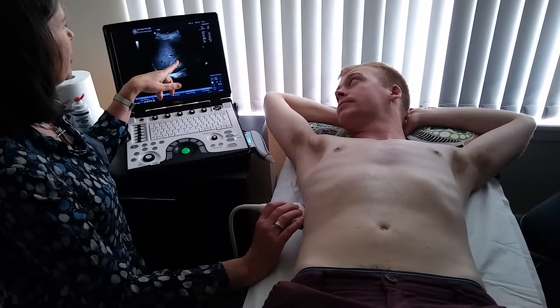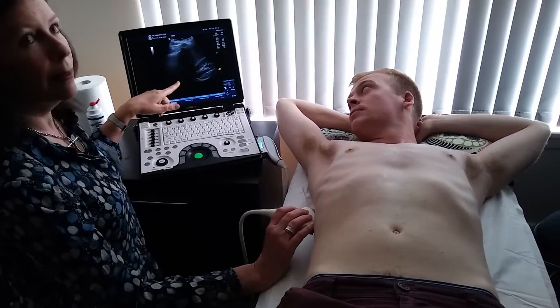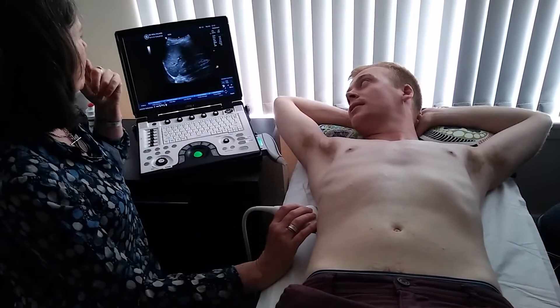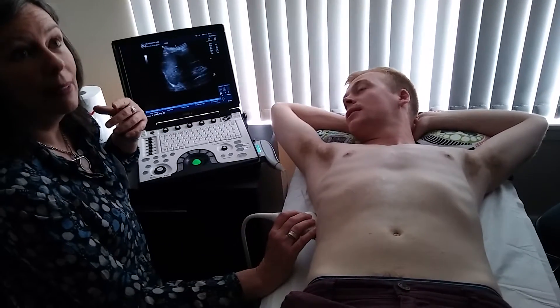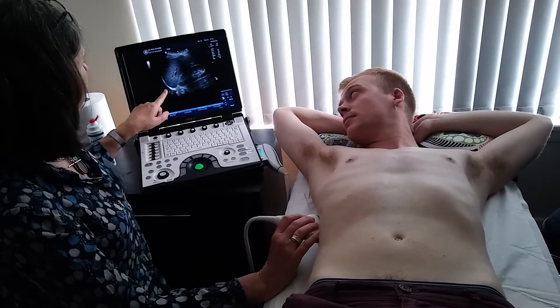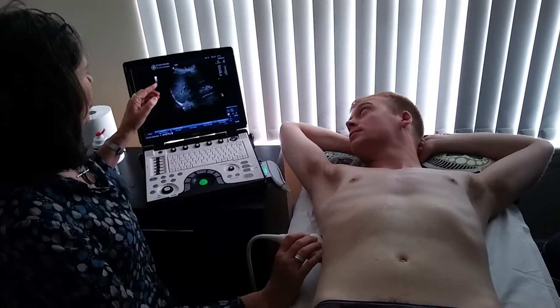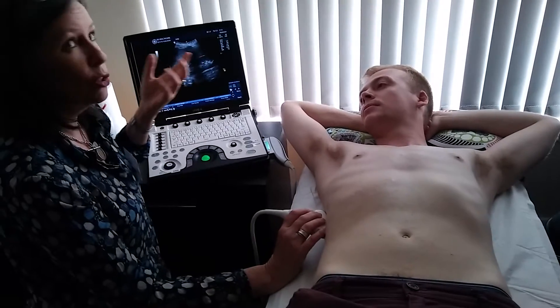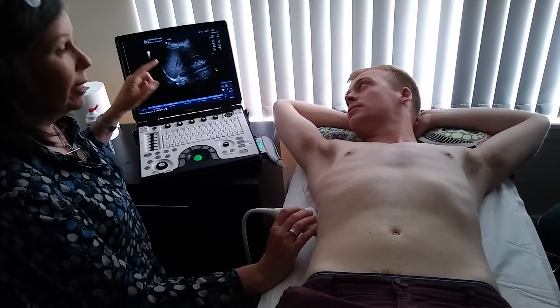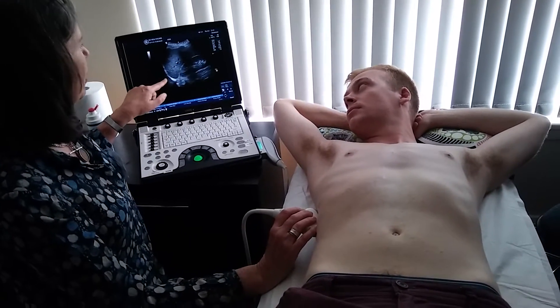I've got Morrison's pouch - are you happy with that? If I just sneak up here, look at this. Anyone want to hazard what that might be? Is that the diaphragm? Yes. So this little corner here, this little wedge above the diaphragm - what would that be? It's lung. But it's not the organ of lung - it's an artifact. Can you see how this tissue looks like that? It almost looks like another liver. So this is a mirror artifact. You never see lung unless it's consolidated and the air's out of it. So this mirror artifact just tells me that this is normal lung. As soon as it's a hemothorax, this would be a black wedge. If you can't see a black wedge and it looks like you've got two livers, then it's a normal lung.